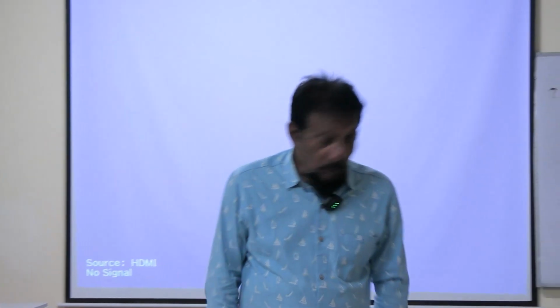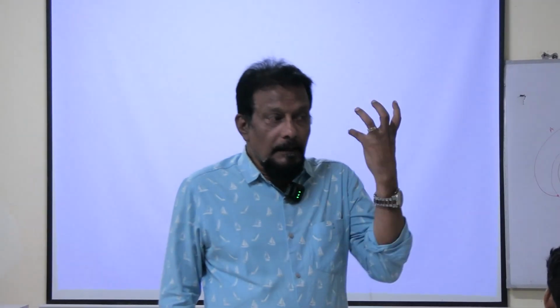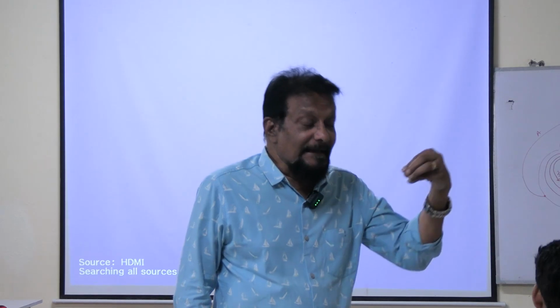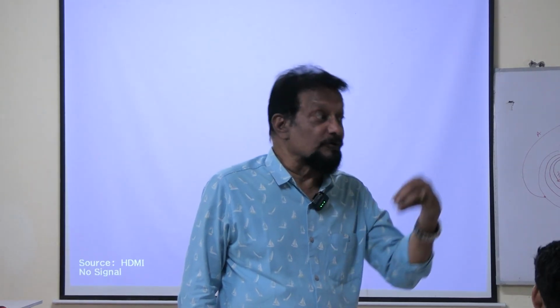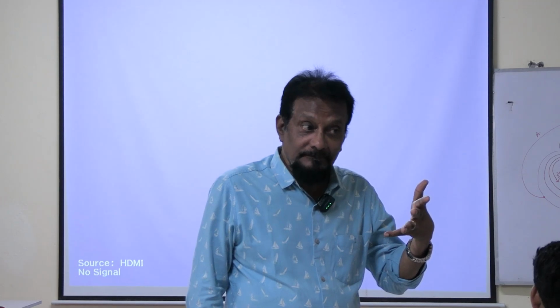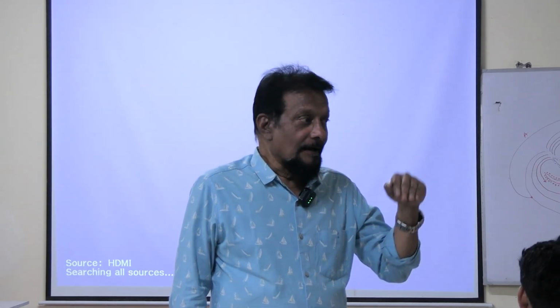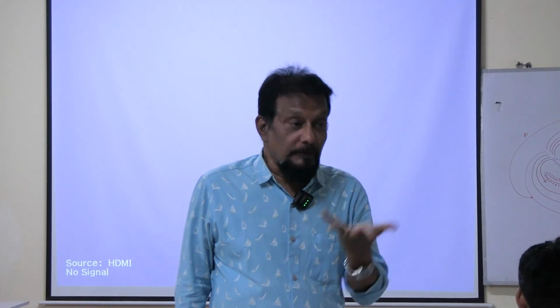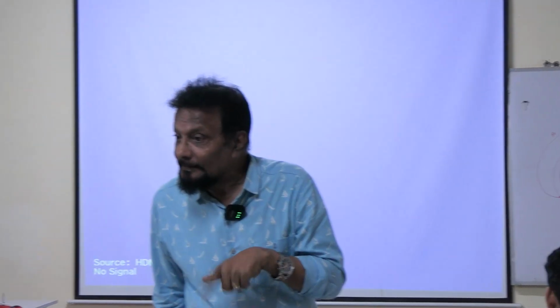And not only this, whether the myocardium is getting enough blood, enough oxygen. When sufficient oxygen is not supplied to the myocardium, that means ischemia, and the ECG will show some change. With that you can diagnose myocardial ischemia.